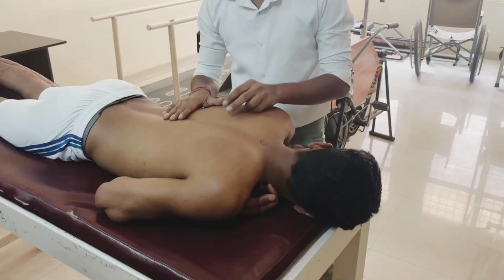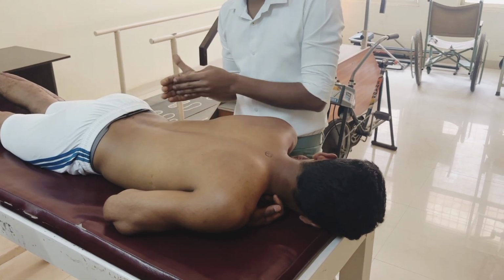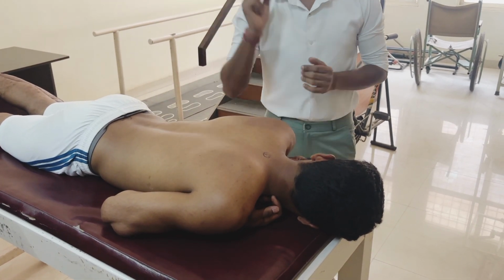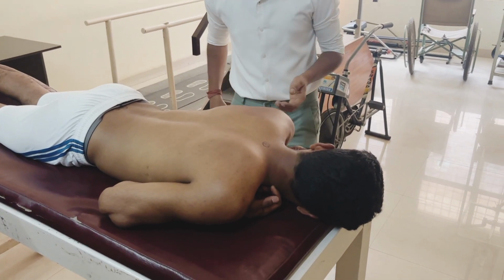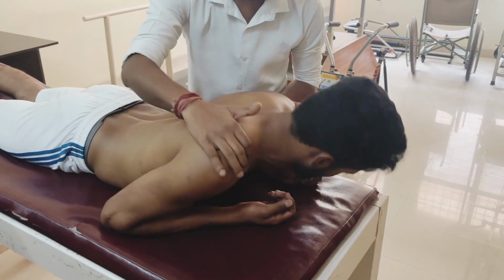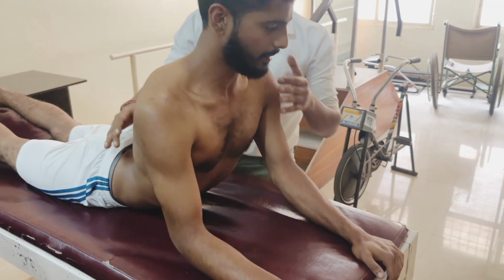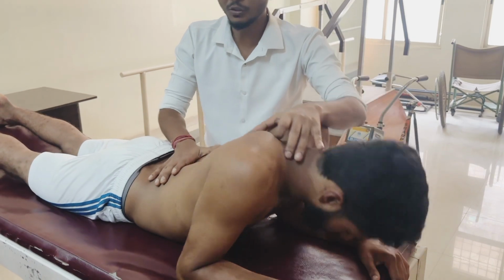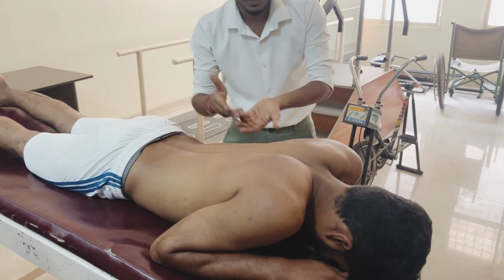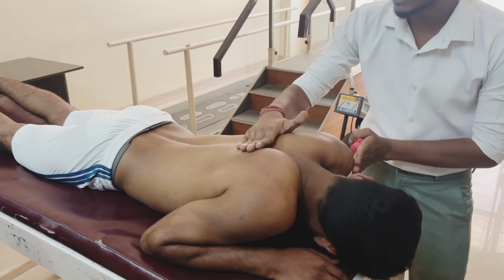Here, the thoracic spine and lumbar spine together, we are going to measure extension with the inch tape. To check that, we will ask the patient to do extension. The patient has to do extension like this. First we will do it passively. Okay, relax. First we do it passively so that the patient will understand what this extension movement is.